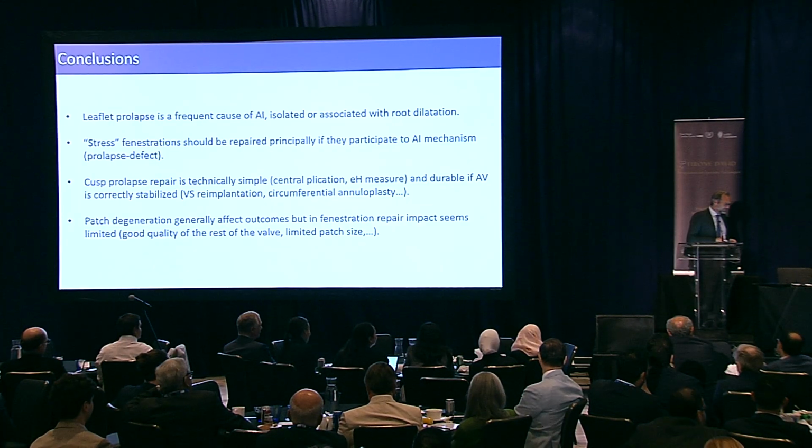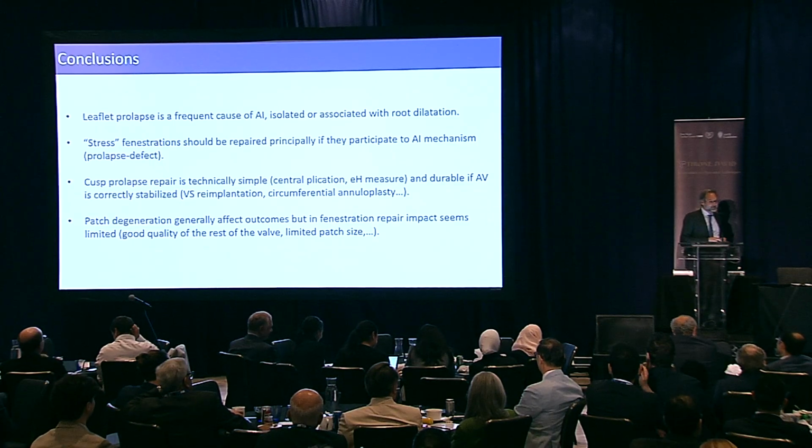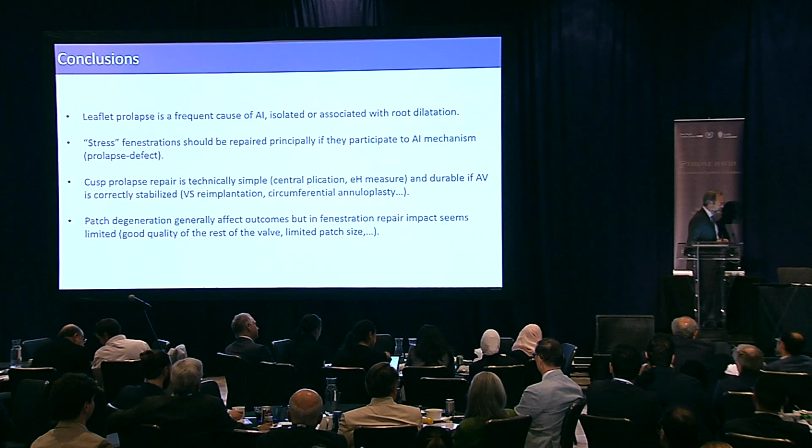So yeah, structural degeneration, of course, is a risk, and that is the limiting factor, of course, of fenestration repair with this kind of material.